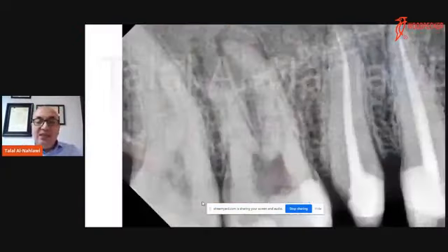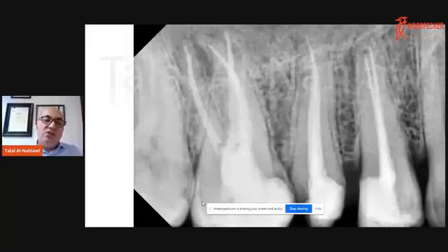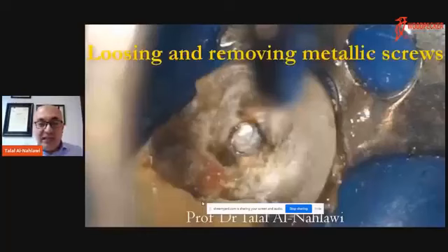And at the end, you can see how precise it was and how the furcation was preserved without any additional removal in this dangerous area, and this helped us to do the root canal of the case. So it's very important to use them whenever you can see a huge calcification in this area.